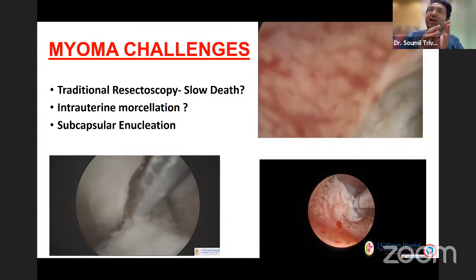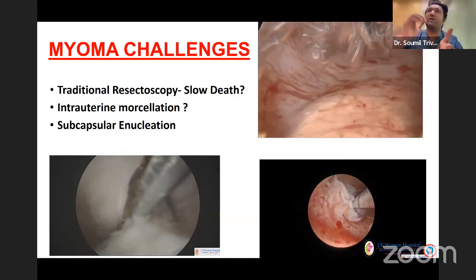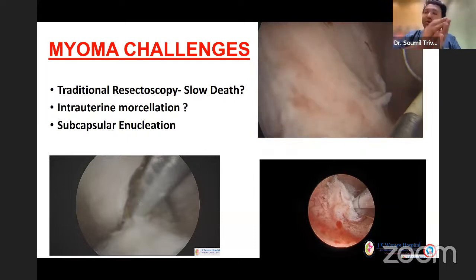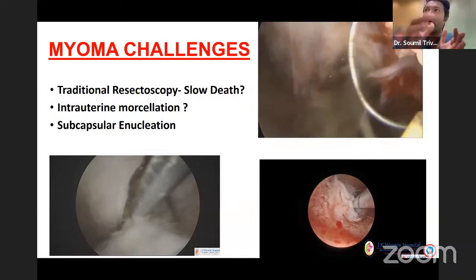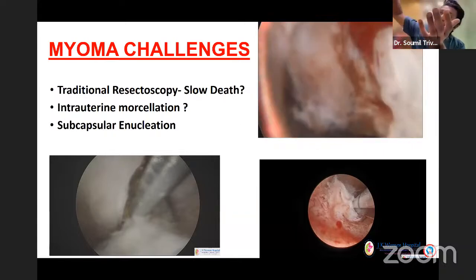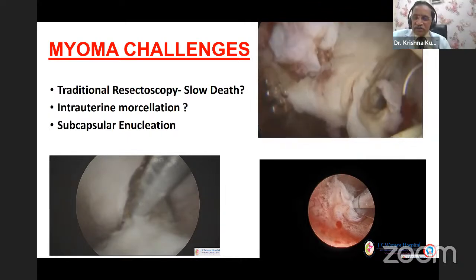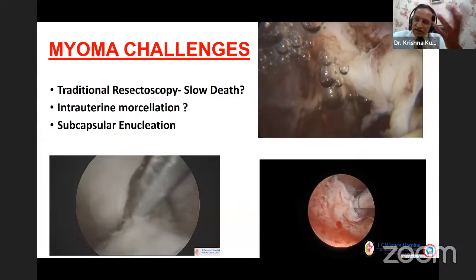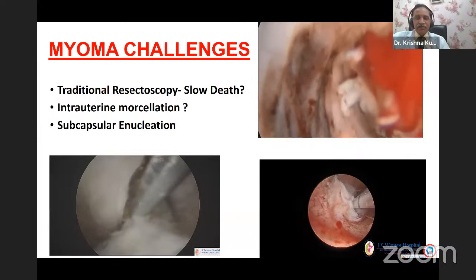I'm talking for a large fibroid which was targeted hysteroscopically, wherein probably GnRH was given, or something else was given to downsize the fibroid. Now, with downsizing by medicine also, you cannot target that only the submucous part will get reduced and the intramural part should not get reduced. Right. Now, the hysteroscopic surgery, you can stop anytime and restart anytime later also. Next day or after 10 days, anytime. Yeah, that is the advantage.